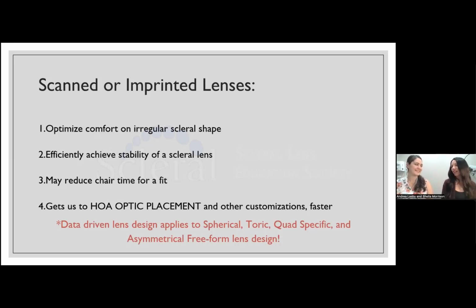I actually have one tech. Her initials are BB. You know what I'm talking about. I was running behind, and I didn't actually ask her to do this, but she knew me. This is a patient that I had put some instructions in, but there's one piece I'd left out. She was able to go and use our profilometer herself, having seen me do it enough times, to pick a starting height of a lens. It was no guesswork. She knew exactly what height to start with as a non-optometrist, as our technician, just by pulling the data from measurements that we had taken for this patient. And it saved my butt that day in clinic, let me tell you. So that was a big time save.